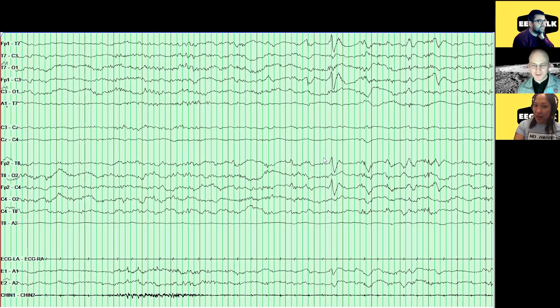It's just something to keep in mind that if they're under 48 weeks of corrected gestational age, and they have more of a morphology like what we just saw, that they could just be normal frontal sharps. And oh, there's another very nice frontal sharp. You know, it catches the eye, right? You think, oh goodness.